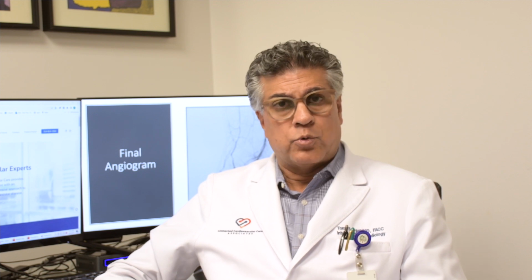After the procedure, you will frequently be at bed rest for a few hours, 2 to 4 hours, to make sure there's no bleeding complications, there's no issues with the medication, and that you're safe to go home. 95 to 98% of our patients will go home on the same day. There are some procedures for which we will keep you overnight. Those procedures include the valve procedures that we do for TAVR, patients that have carotid stenting, and patients that have aneurysm repair. But for most of the heart procedures, you can assume that we will likely send you home the same day.